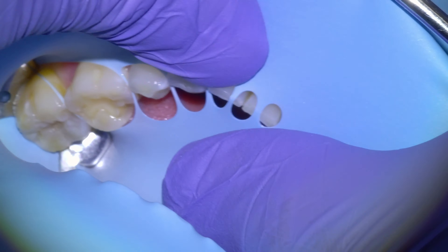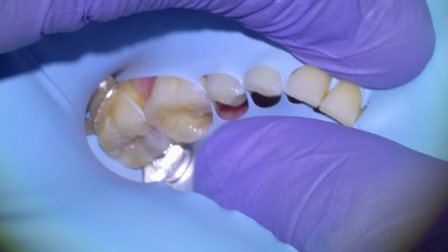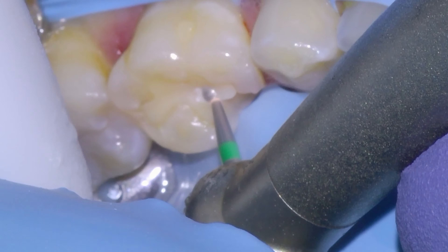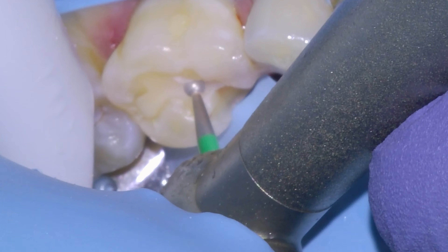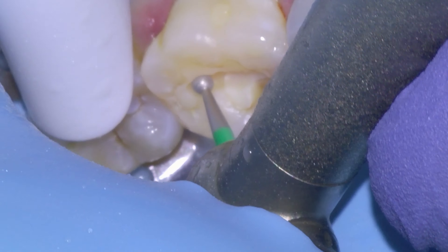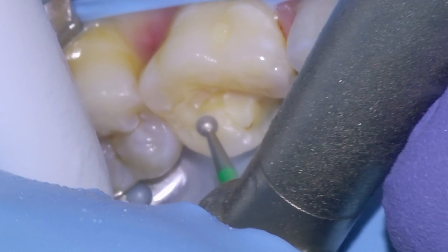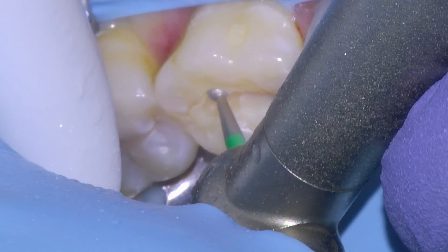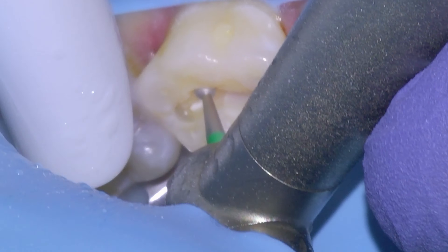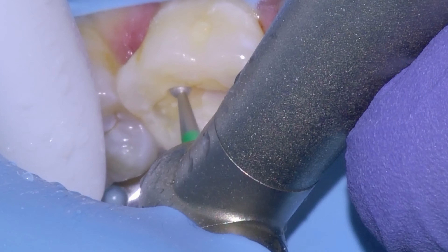There's the broken tooth — it's the first molar, and the front tongue-side cusp has fractured away. It had an existing composite filling, so the plan is to remove the old filling, put a band around the tooth, and fill it all back up with a new filling. You could make an argument to put a crown on a tooth like this, but it would probably be overkill — there's plenty of tooth left to retain a filling replacing that cusp.